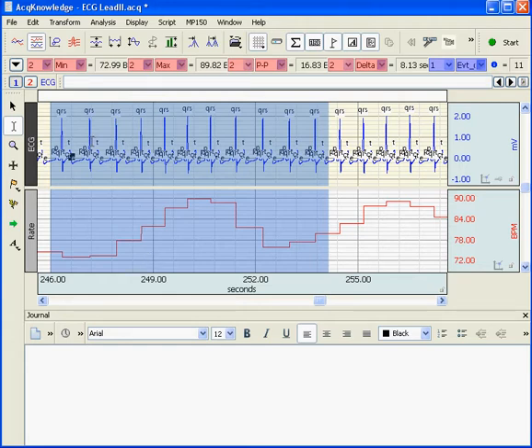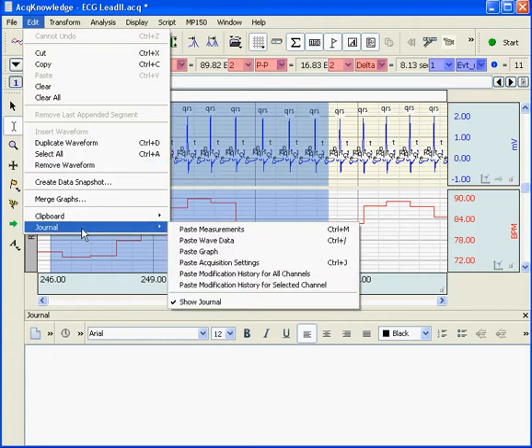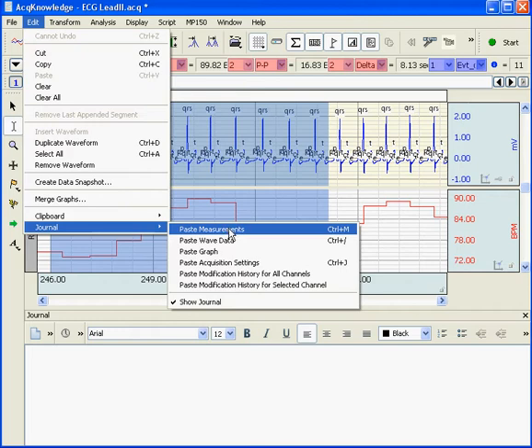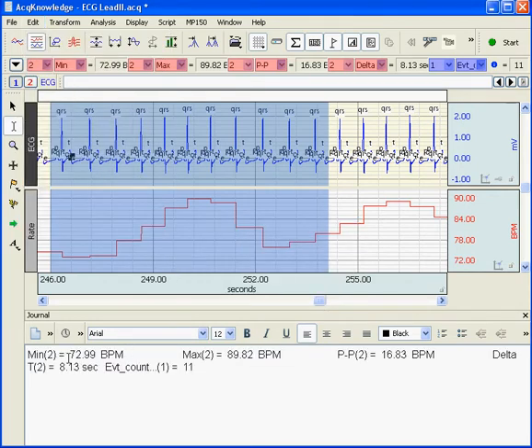One of the nice things about the measurement system and the journal is it is a handy way of extracting information from the raw data, saving it down into the journal, and then you can use it for further analysis or to email to a colleague. To do that, go to the Edit menu and the Journal submenu — there is an option there called Paste Measurements. Now I have pasted this information down into my journal.